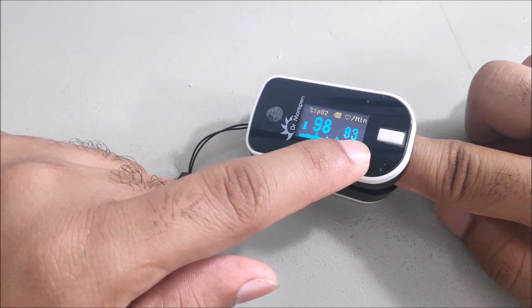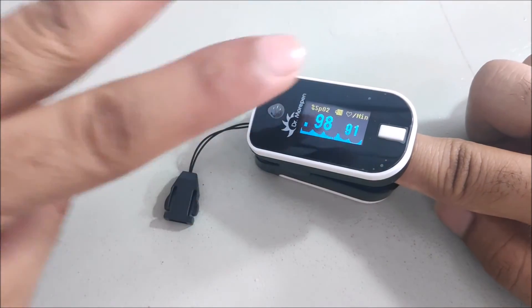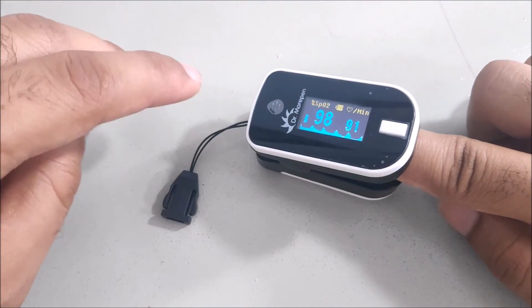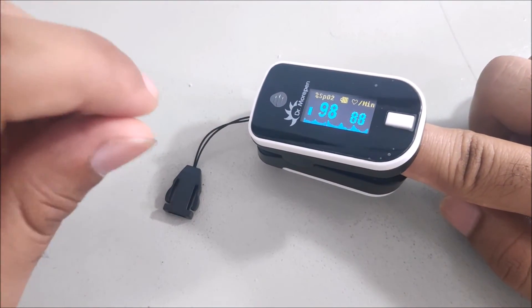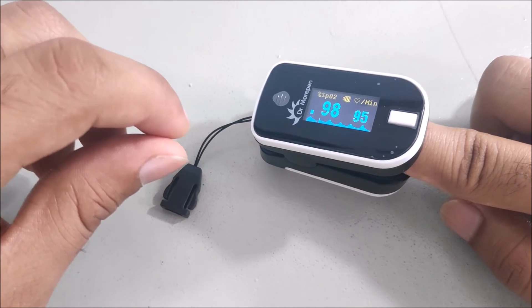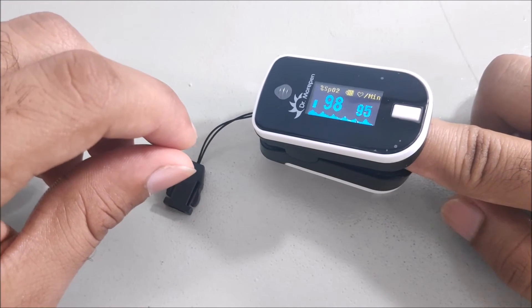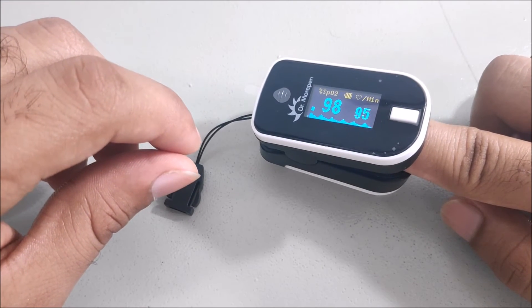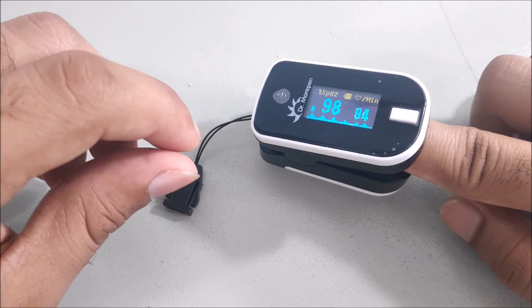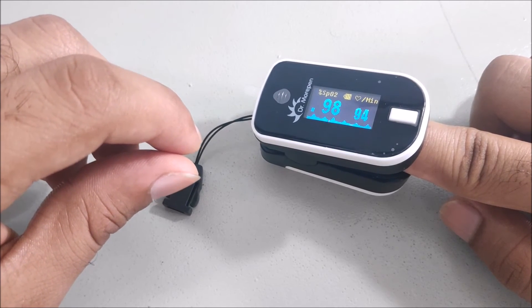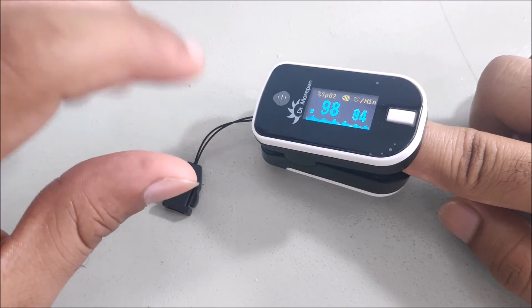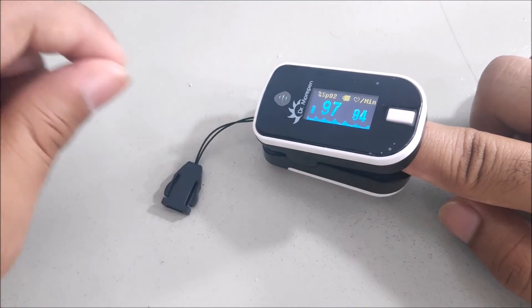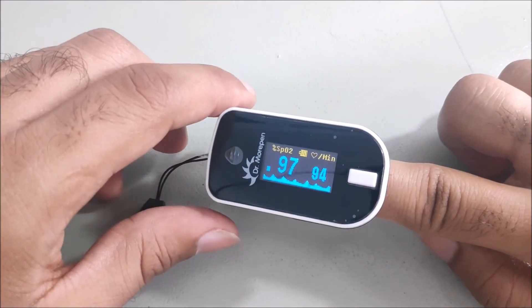These are the basic two things we can get from the pulse oximeter. It is advised to use the pulse oximeter for at least one minute to get accurate readings, as sometimes it may fluctuate. So it's important to get the proper reading for one minute.